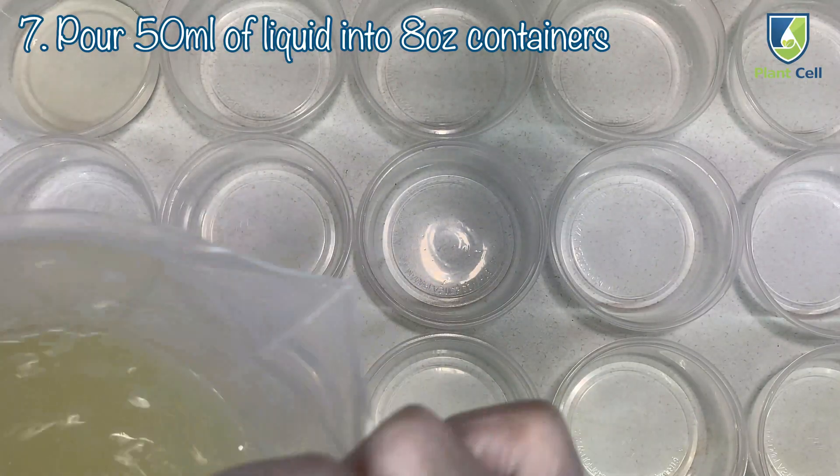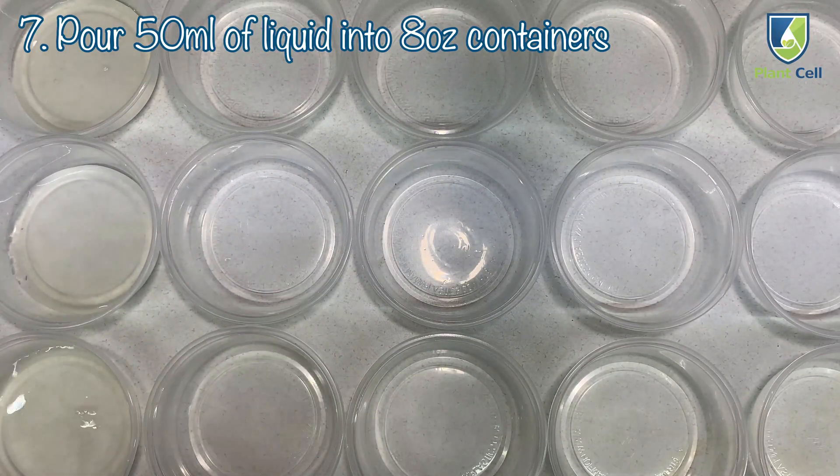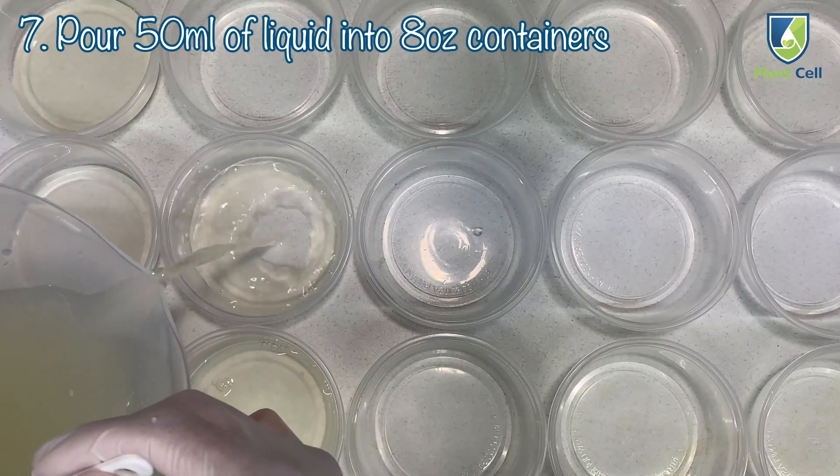Pour 50 ml into each 8oz container. There should be 20 per 1 liter of liquid.